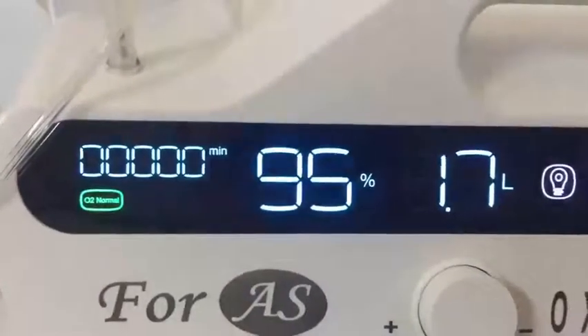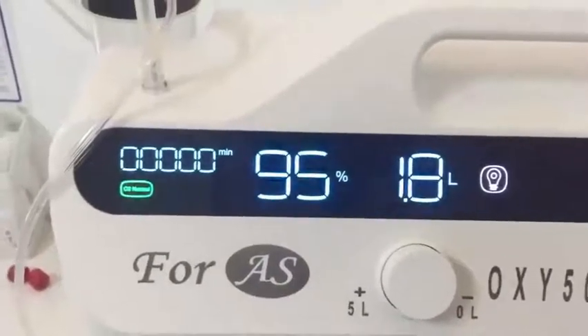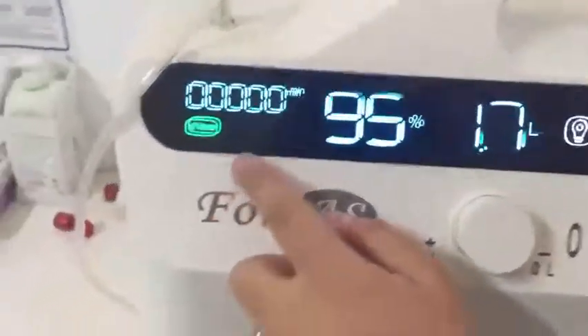When the purity level falls below 82 percent, you will see an oxygen low warning while the device is operating. Be careful and make sure that there is no carpet behind or under the device, and no material that can negatively affect or obstruct the operation of the air filters.